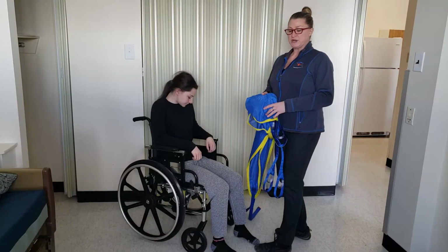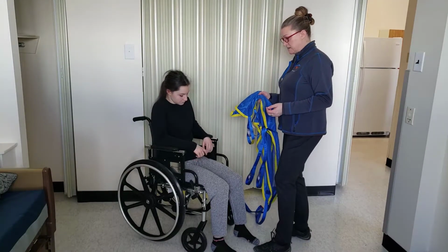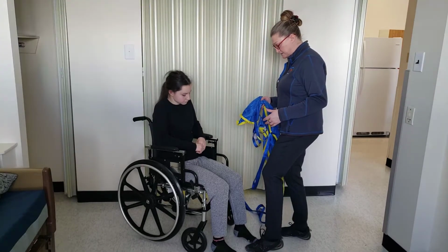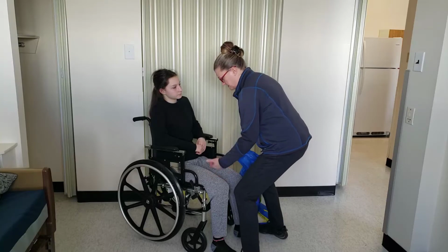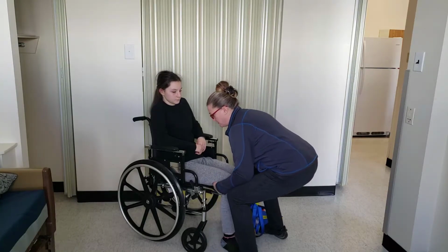Sling placement in the wheelchair can be done from the front or from behind. If the tenant cannot sit forward independently, if they need a bit of assistance there, we can do this from the front. So what that looks like is we might have to bring their buttocks forward a little. You can do either one leg at a time or both at the same time, depending on the tenant. So you just bring them forward a little.